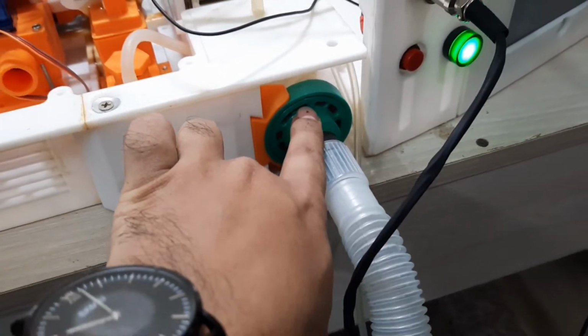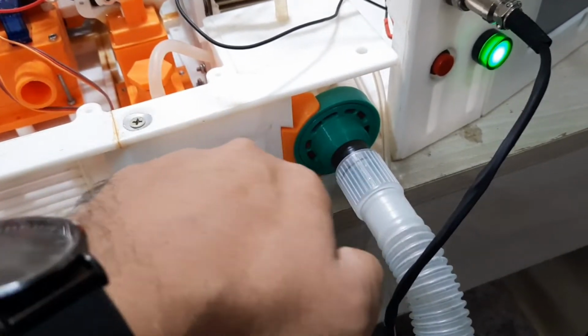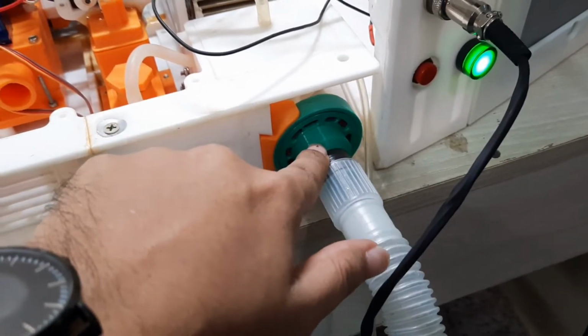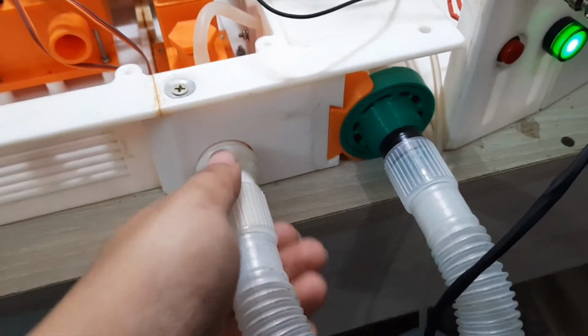And here you can see this is our own PEEP valve. This is working really well and is very cost efficient. Maybe we can make this PEEP valve for under $1. And here you can see the one-way valve.